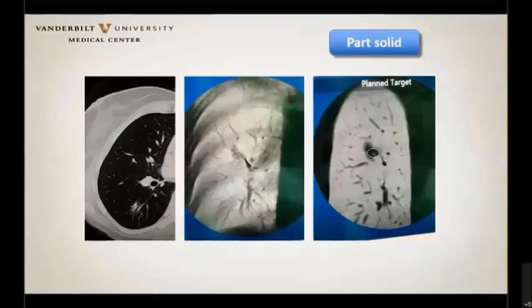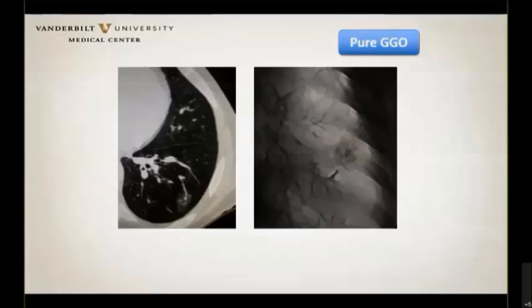The main issue with this is that, similarly to what Krish was saying about cone beam CT, if you're not careful about your ventilation strategy, your PEEP level, you will get some atelectasis and it will become difficult to see. And this is obviously going to be more likely to happen in the lower lung zones, near the diaphragm, and near the mediastinum as well. Here's a pure ground glass opacity right here. Not sure whether we're going to be able to see it, and you can see the corresponding image here on the digital tomosynthesis.